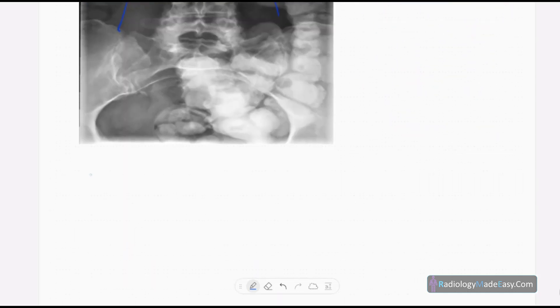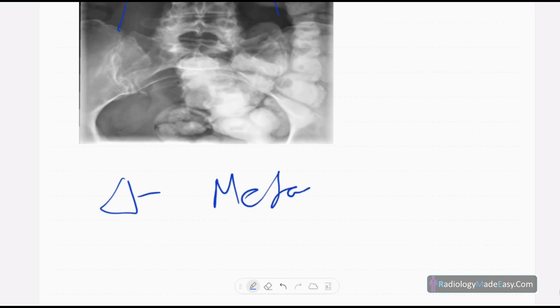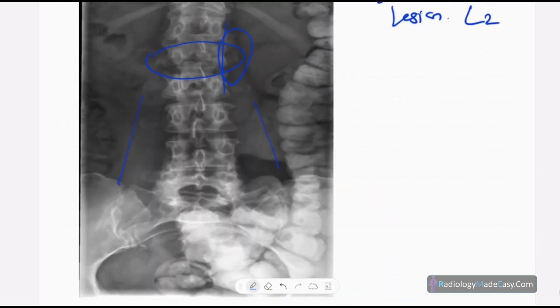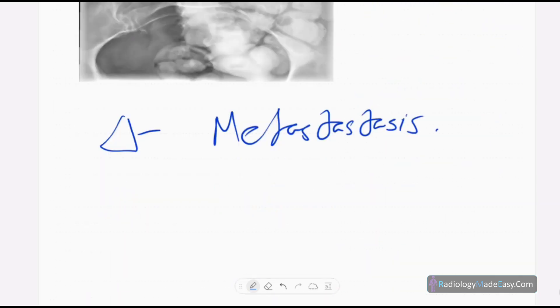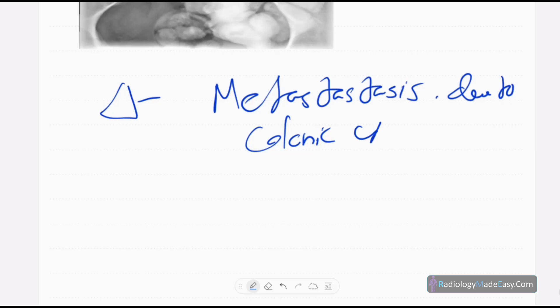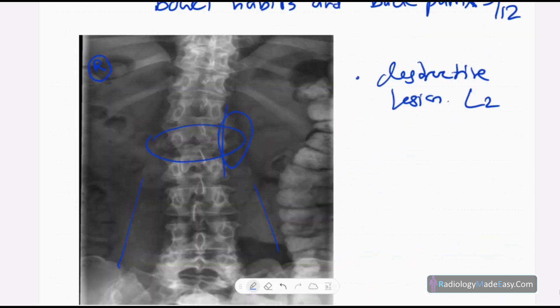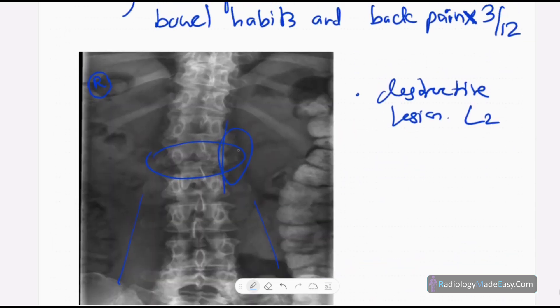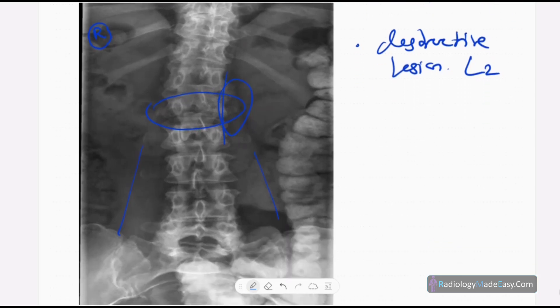The diagnosis in this case is metastasis. In an older patient — especially a 63-year-old — you have to think about metastasis when you see a lytic lesion. This is a secondary deposit rather than a primary tumor. The metastasis is due to colonic carcinoma; the patient had altered bowel habits and back pain, with the back pain caused by this destructive vertebral lesion.